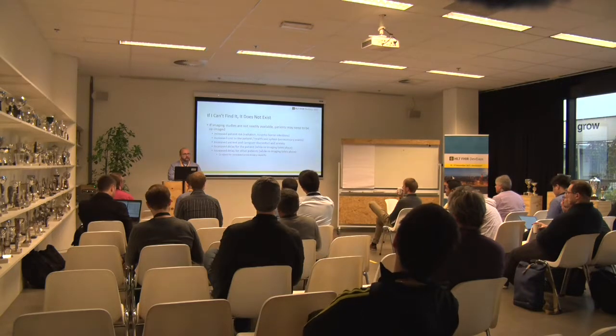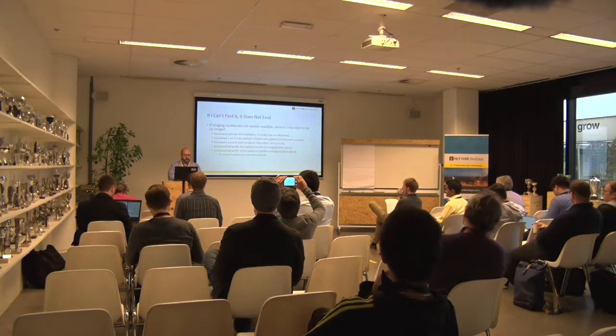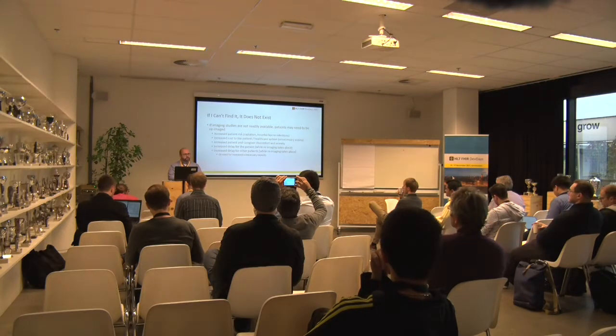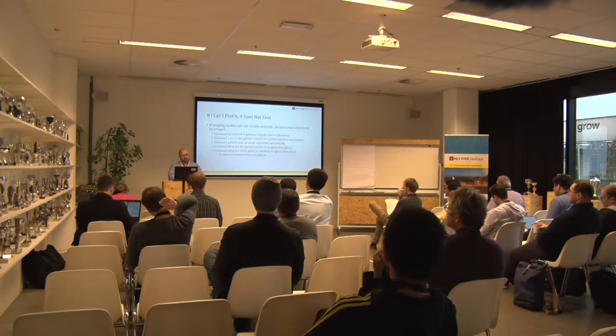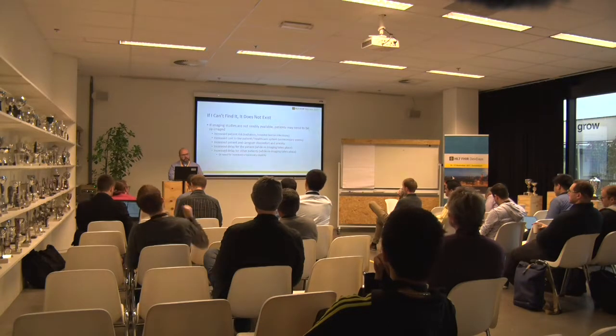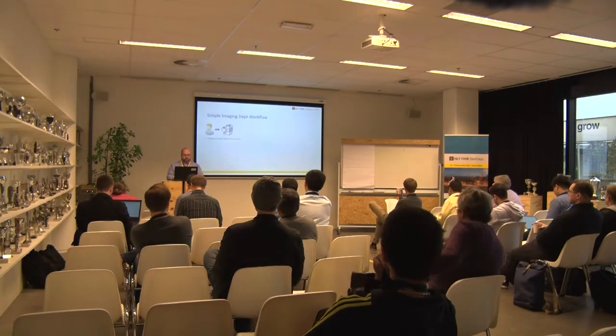If you have to re-image the patient, they're put at risk for increased radiation, or also getting hospital-borne infections like C. difficile, that sort of thing. It costs more. It causes discomfort and anxiety, like if they have to get injections or move in certain ways. And it delays the patient because they have to be re-imaged, and it could also back up the healthcare system as well if they have to re-image a bunch of patients that they didn't need to.